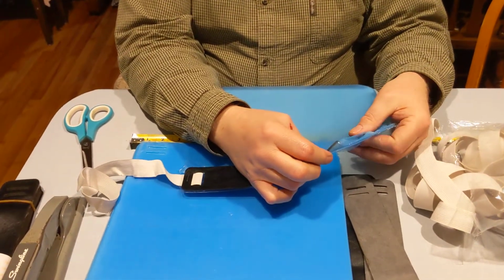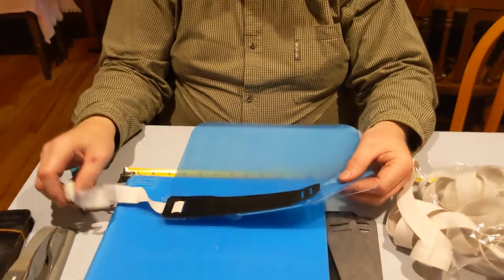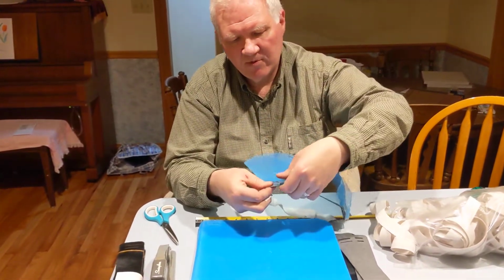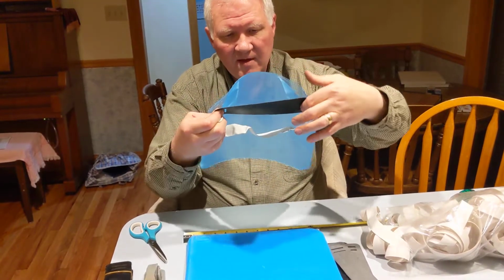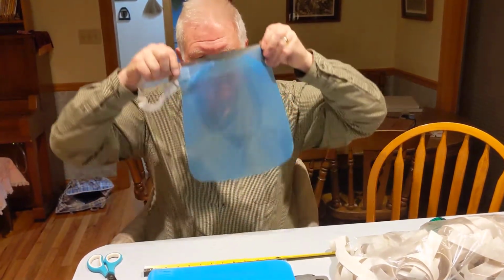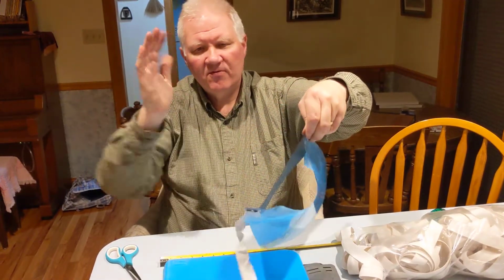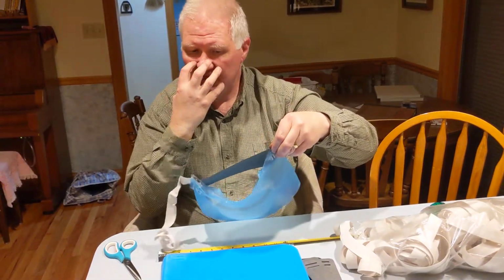Then for some users, they have asked that they can finish the assembly so that they could adjust it to make it tighter or looser. But to make it ready to use, and it does fit most faces pretty well, you simply follow the same procedure. Now, it is working the way it's intended, in that the headpiece that touches the forehead is shorter than the face shield, which allows the face shield to be held away from the face to allow room for a face mask and for goggles or eyeglasses. That's why it's purposely flexing away from the front of the face to make room for eyeglasses, goggles, and a face shield.